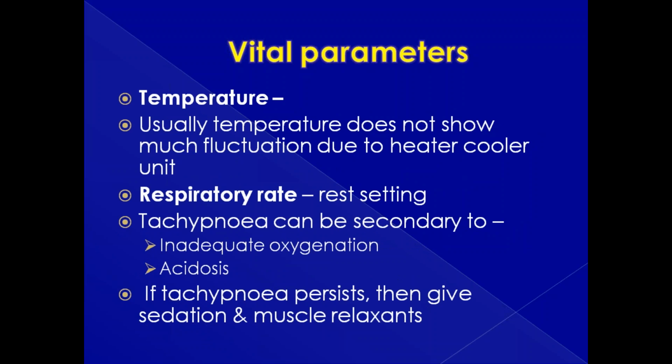Temperature. Usually your ECMO patients do not show hyperthermia. The reason is the ECMO thermostat: on the control, you indicate the temperature at which you want the blood to go to the patient. If you indicate normothermia, as it circulates through the patient, your patient will have normothermia despite the fact they have sepsis, despite the fact they are pyrexial, they tend to display normothermia. So be careful about that. Fever is not an indicator of sepsis when the patient is on ECMO.